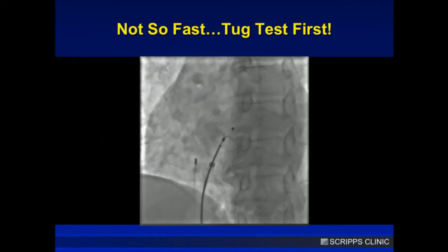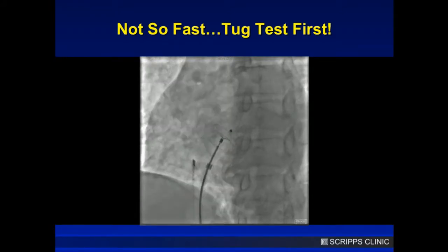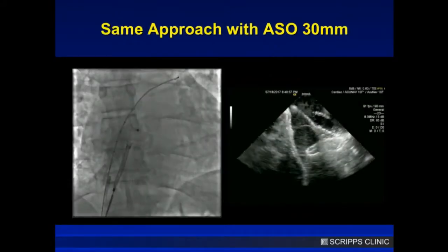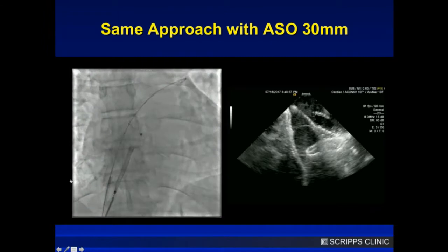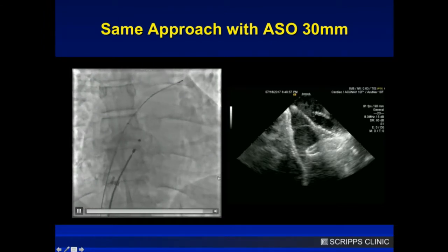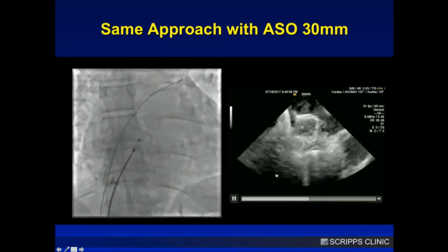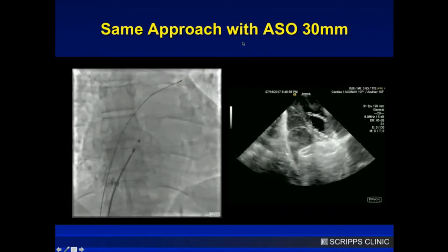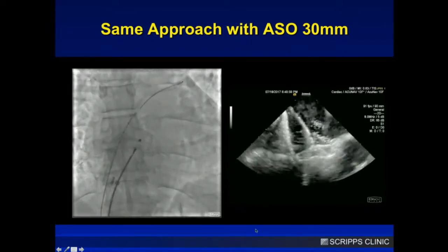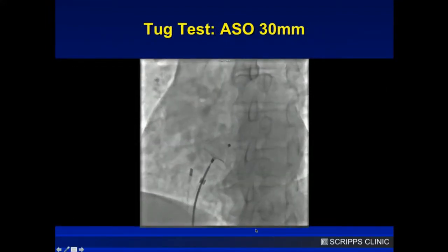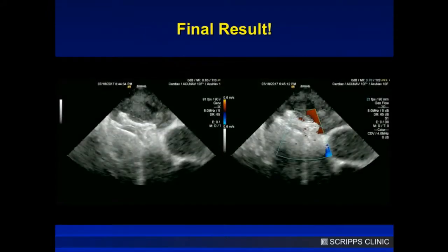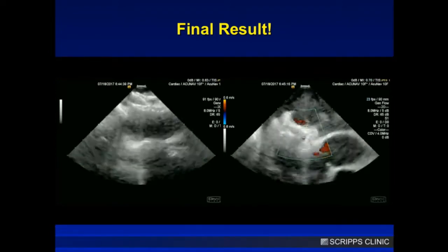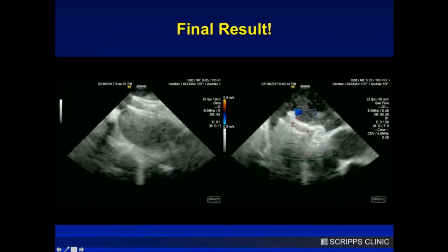Then I do a tug test — and it falls out. So I upsized to a 30-millimeter device. On ICE you can see beautifully how the balloon is across, pushing the left disc away from the aortic rim. I really wedge that balloon in there. After deployment I pull the wire with the balloon, then the wire. Here's a really good tug test — pulling, pushing in, pulling — it's not going anywhere. The final released result is perfect: not oversized, flat, and not that much interaction with the aorta.